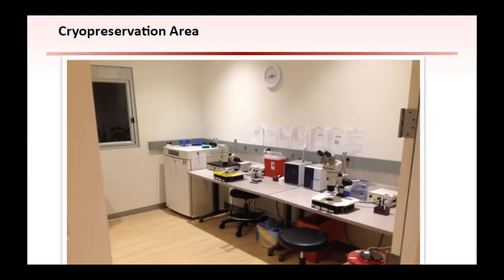Pictured here is the area used for freezing and thawing embryos. It is in a separate area of the embryology lab in order to minimize activity and allow the embryologists to be focused on their work. Separate workstations are used by each embryologist for each patient.